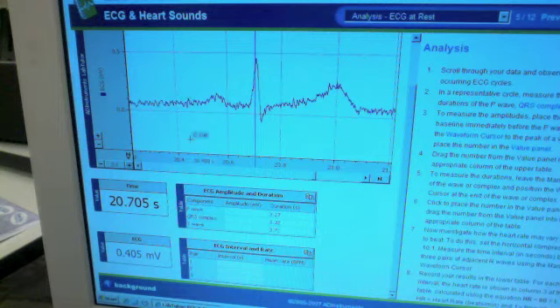The next part of this tells you to do some measurements, and what I've done is I've scaled one of these particular EKG events to a point where it's pretty easy to see. This would be 1 heartbeat, so here the heart would be resting. Actually, up here would be resting. This is the P wave, which we'll talk about in class. It's actually caused by the atria contracting. Then we have the QRS, which is caused by the ventricle contracting. And then we have this T wave, which is caused by the ventricle relaxing. So we want to be able to see what the amplitude of each of these are, and we can also measure time between and things like that.